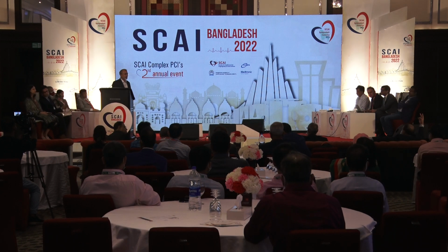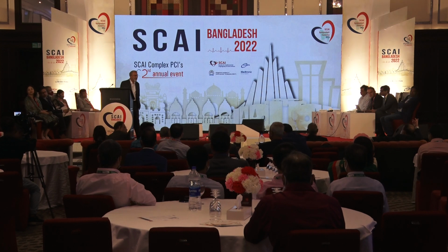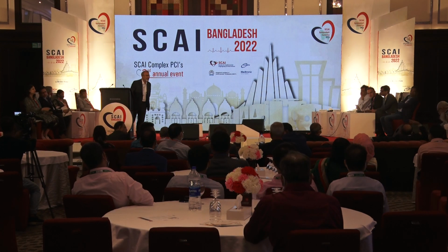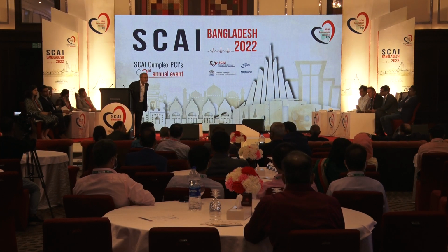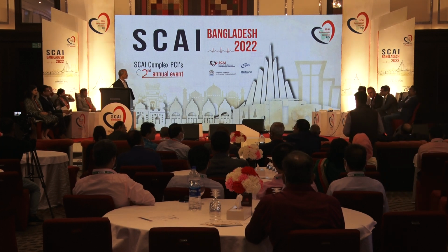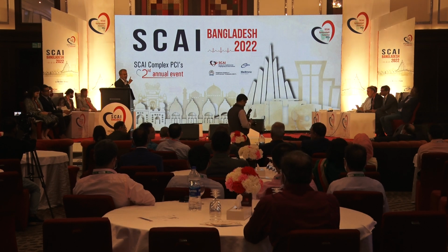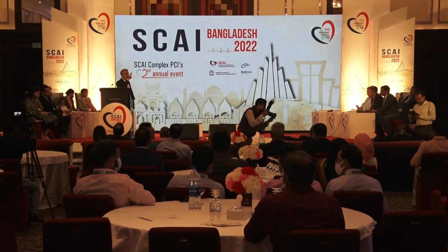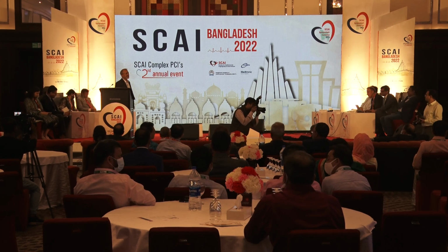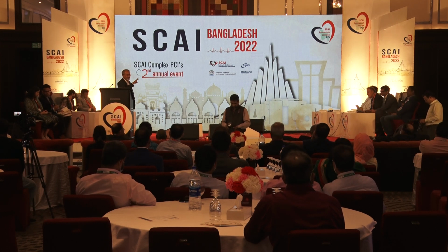The first one is not a double barrel, because this is because of the one vessel that is irritated. No, that was double bullet but single barrel, because from one barrel, that is the LAD, it made two infarctions, inferior and anterior. That is why I said it is single barrel but double bullet.